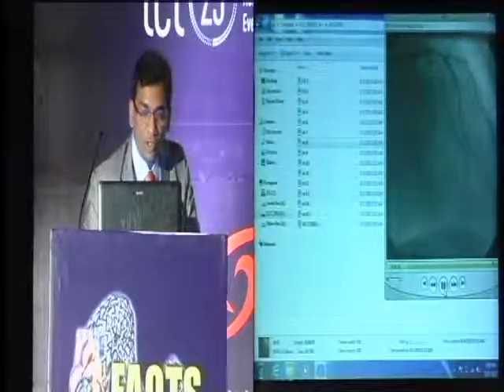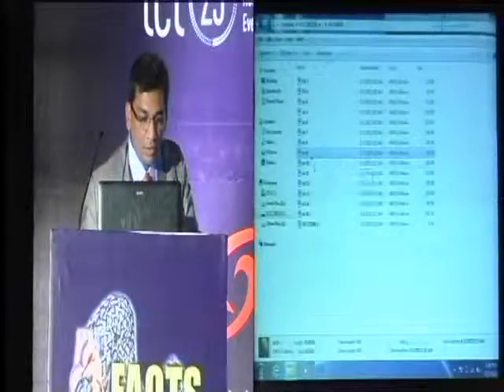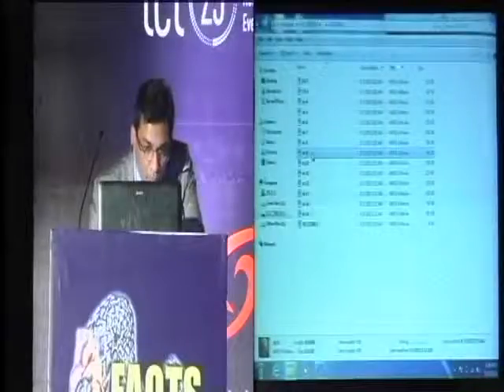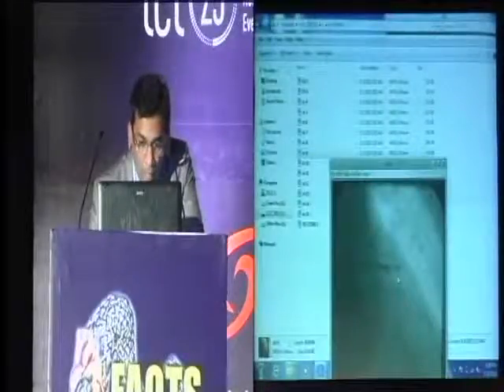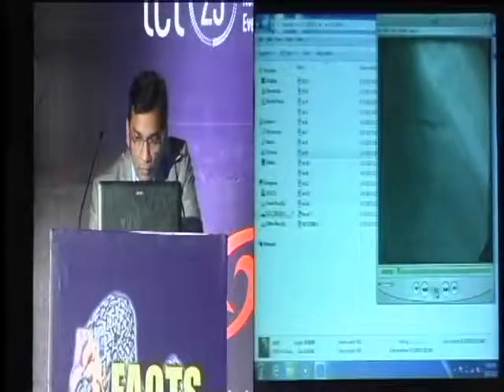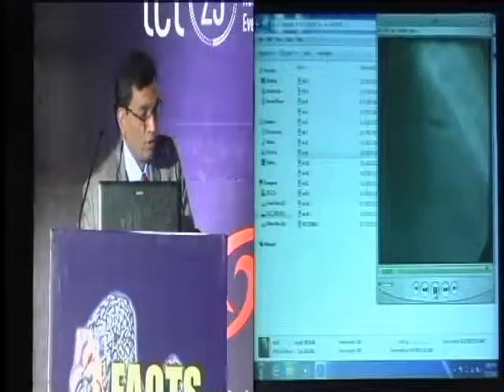As you can see, the LAD flow is better. We then did a kissing balloon angioplasty.